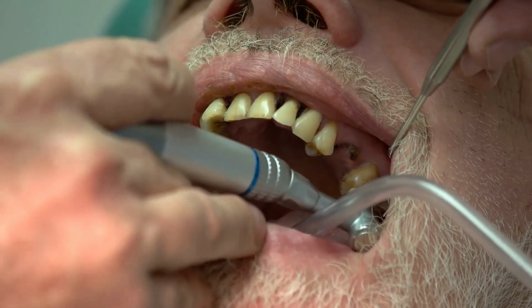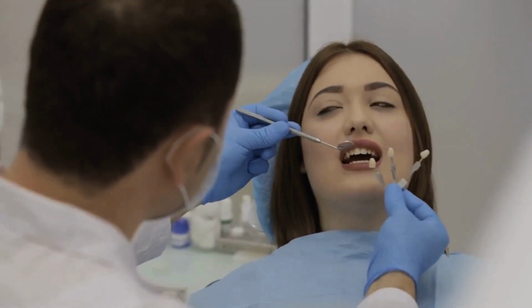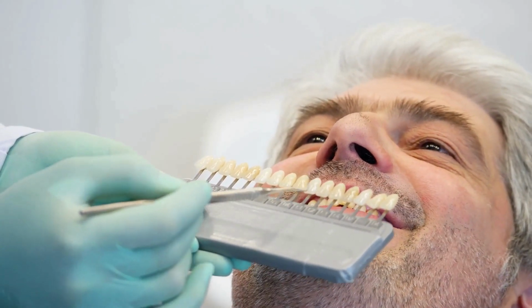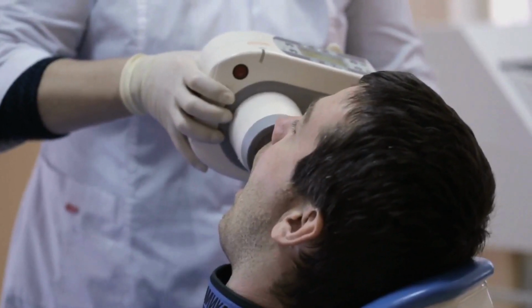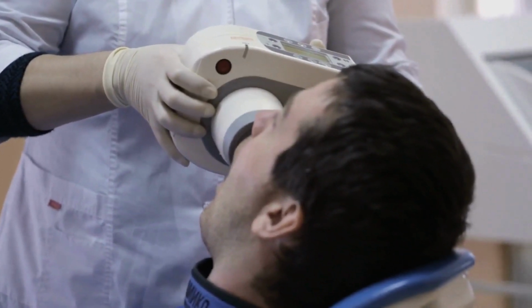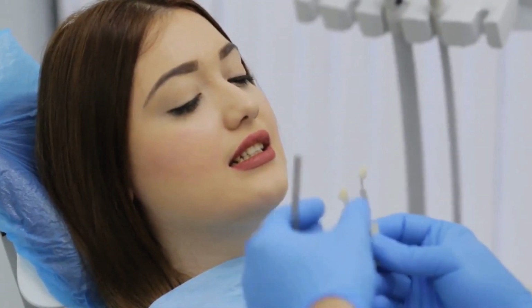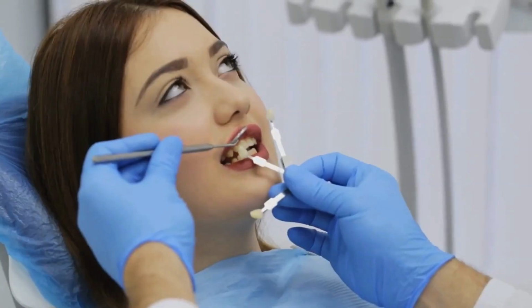Subtle variations in enamel texture, early signs of demineralization, hairline fractures, and other subtle details become readily apparent, facilitating more accurate diagnosis. Secondly, cross-polarized photography improves color accuracy, providing a more realistic representation of the true colors of teeth and oral tissues. Traditional dental photography often struggles with color accuracy due to the interference of reflections and glare. These reflections can distort the perceived color of the subject, leading to inaccuracies in diagnosis and treatment planning. By eliminating these reflections, cross-polarized photography allows for a more faithful representation of the true colors, enabling dentists to make more informed decisions based on accurate visual information.